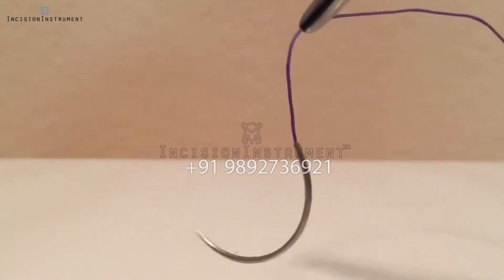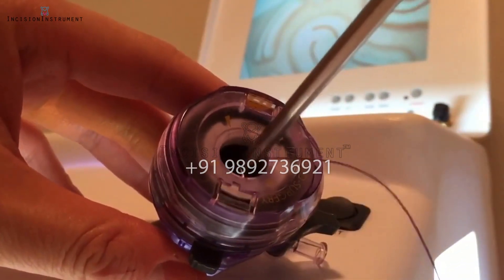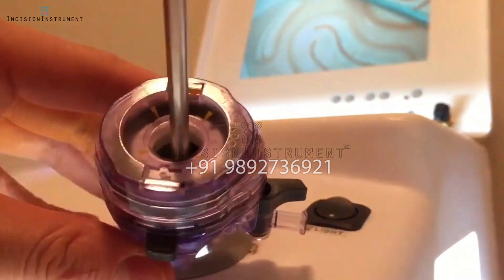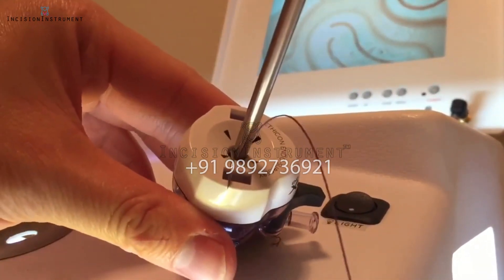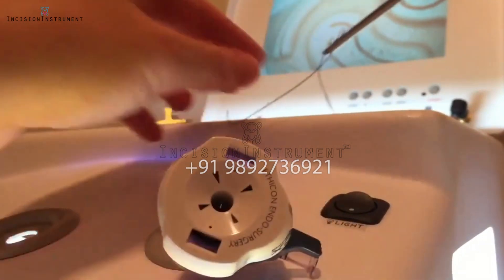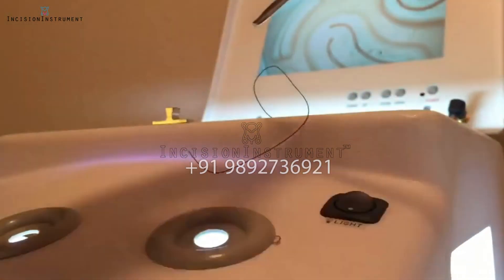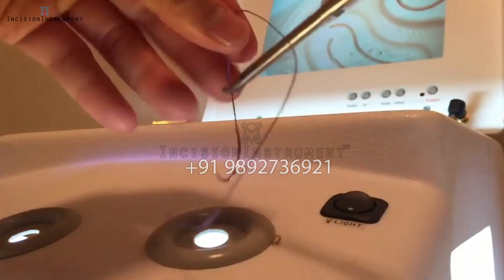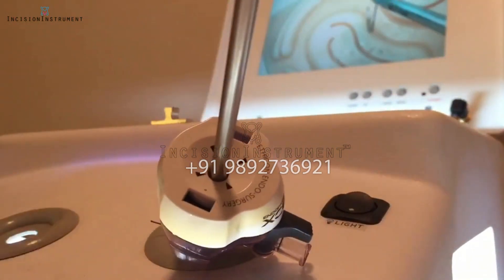Needle entrance. First, grasp the suture at point A, about two centimeters from the needle hub. Then, if you're working with a 10-12 port, you can directly insert the CT1 needle into the abdomen. When working with a 5 millimeter port, you won't be able to directly insert the CT1 needle. You will need to first insert the instrument through the trocar, then grasp the suture and guide the needle into the abdomen. This is called backloading the needle.